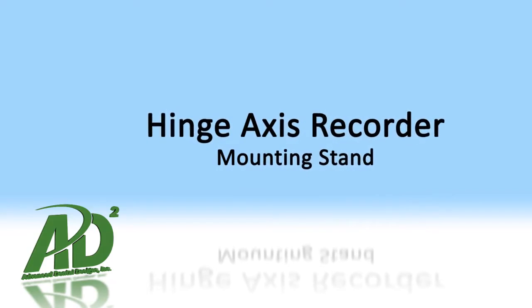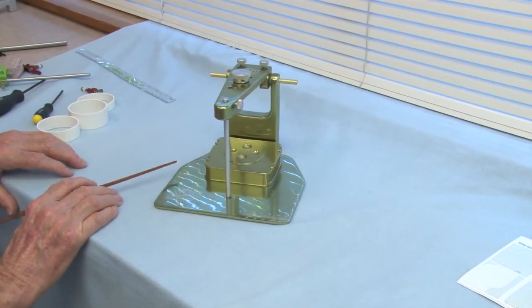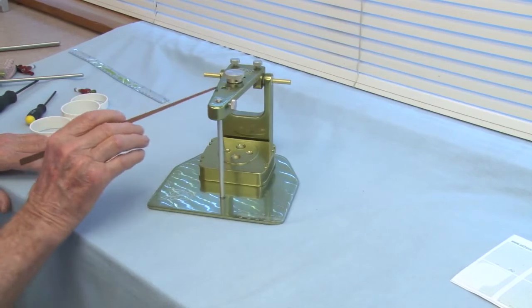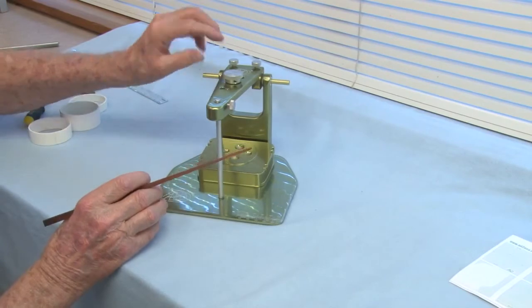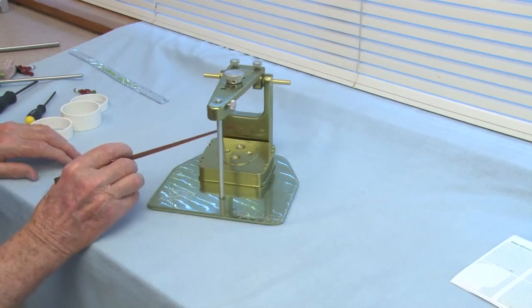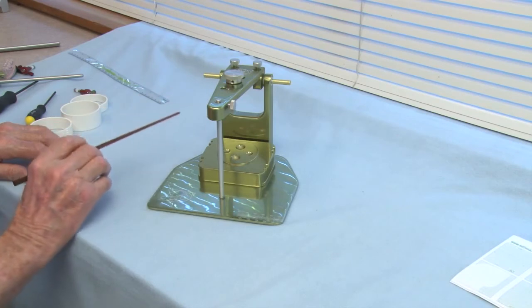This is the hinge axis mounting stand. This is used similar to how you mount the estimated face bow on your articulator, except that we're mounting the actual hinge axis point of the patient onto the articulator. And this is like the top of our articulator. The axis point here is the same as the axis on our articulator. So I can mount my hinge axis model onto this mounting stand and then transfer that model to my articulator, and I've got the upper model on the articulator on the true hinge axis related to the patient.